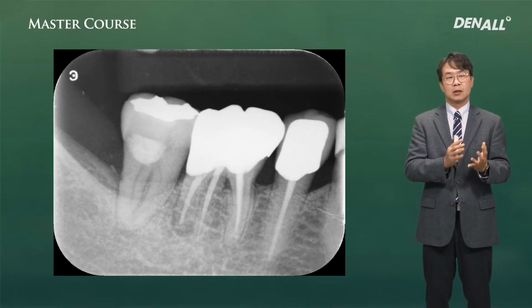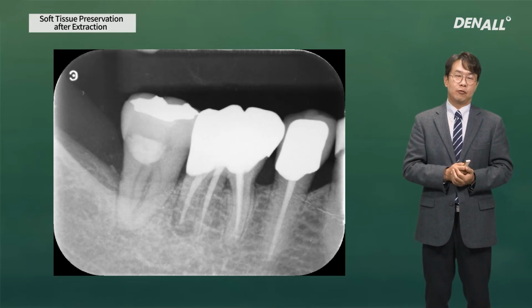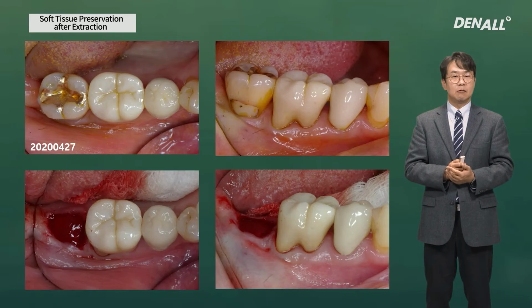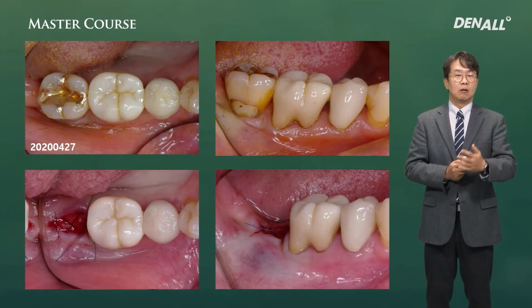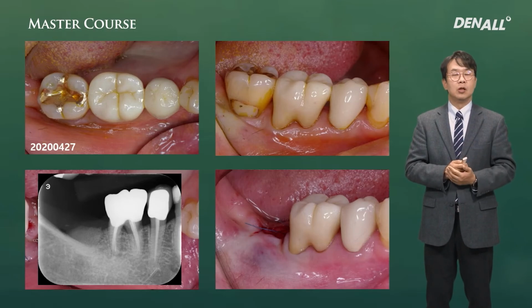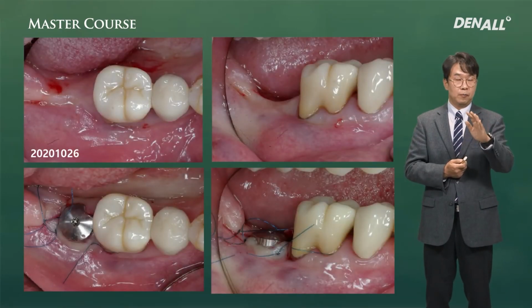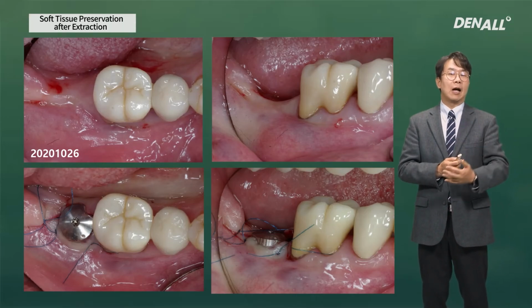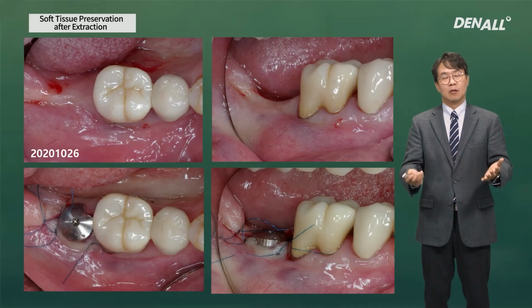Lastly, when we cannot place implants deep, before we place implants, socket preservation can be done. After extracting a tooth where hardly any buccal bone is expected, the inside is completely cleaned and socket preservation is done. After the height is maintained on the buccal side to a certain degree and that's healed, the soft tissue became thicker and the height is maintained. If you look at the tissue, soft tissue and its height is maintained and an implant is placed before finishing it.